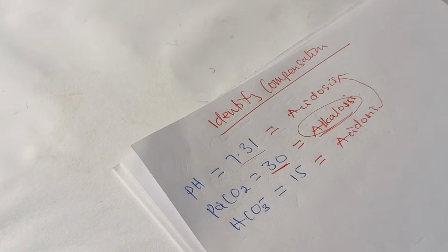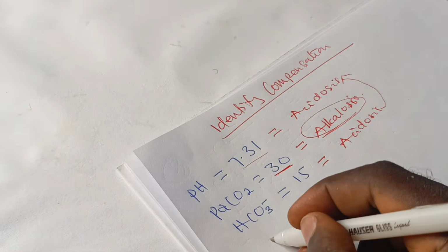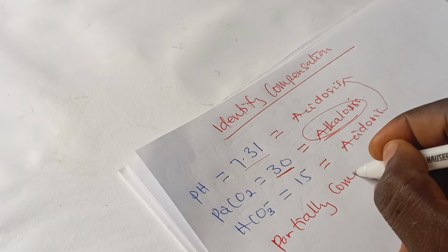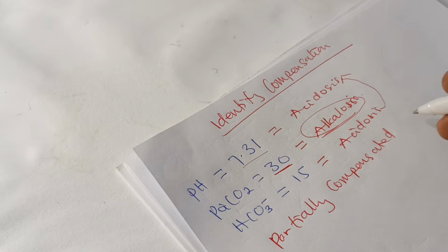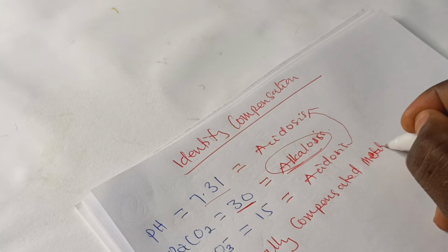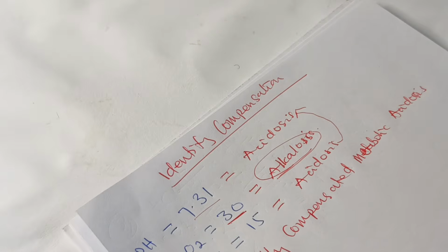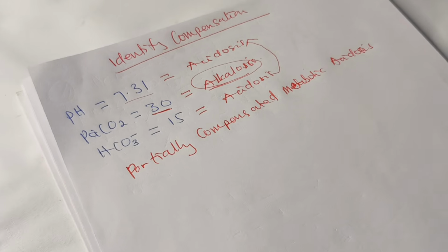So here, the actual diagnosis is called partially compensated metabolic acidosis. Is what? Partially compensated metabolic acidosis.